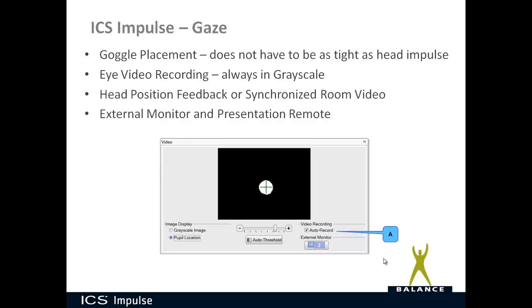For eye video recording, if you have auto record on, even if you use pupil location for setting your region of interest or threshold, the eye video recording will always be in grayscale. You can choose to use head position feedback or synchronized room video for the gaze test — this lets you confirm that the patient is truly holding their head still and looking in the direction you want. You can record that using the synchronized room video or head position feedback, and choose that option under test options, or choose none.